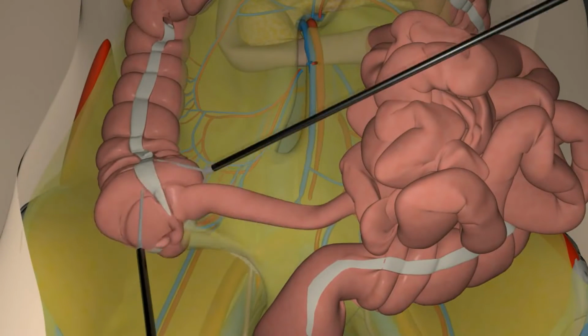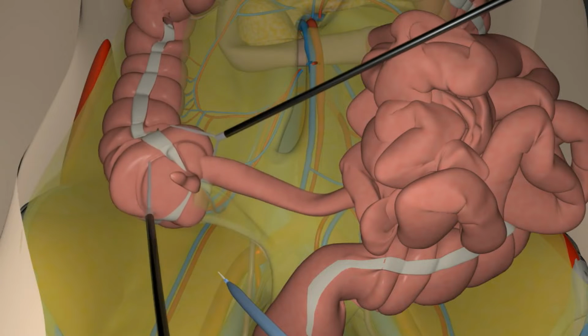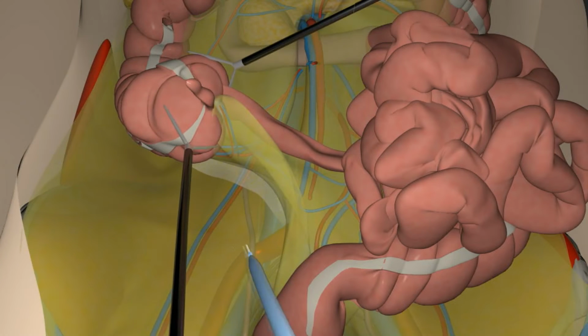Now it becomes clear that the only remaining attachment is the lateral peritoneal attachment along the ascending colon. This area is divided right down to the base of the cecum, and it may even be possible to completely mobilize the appendix and the base of the cecum to the midline from this direction.